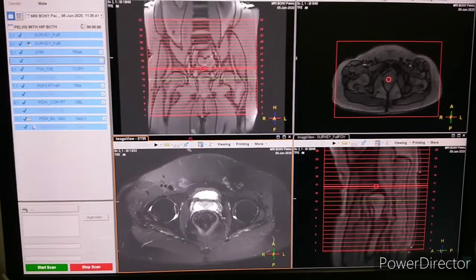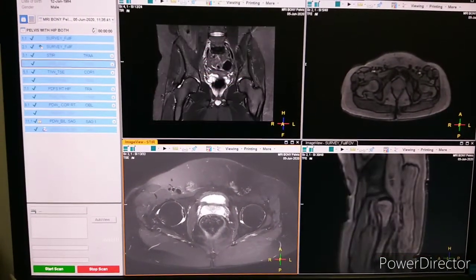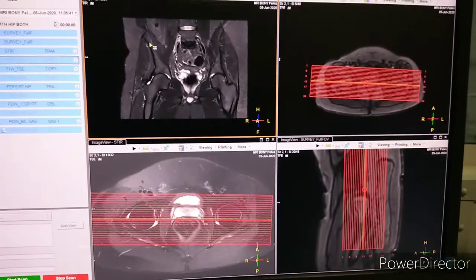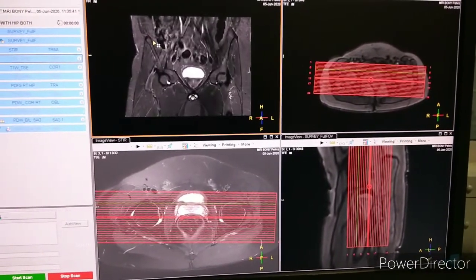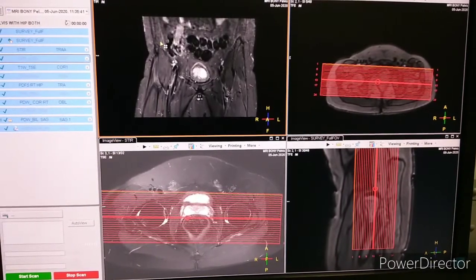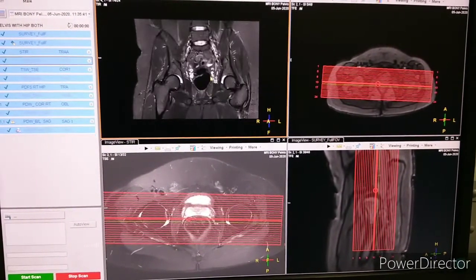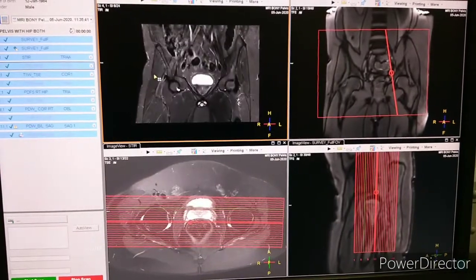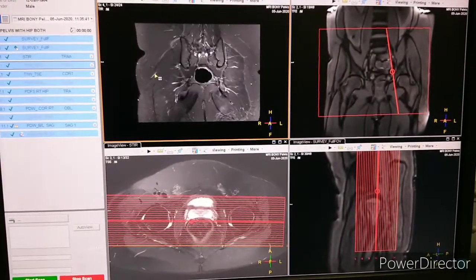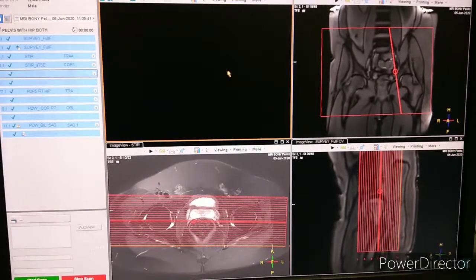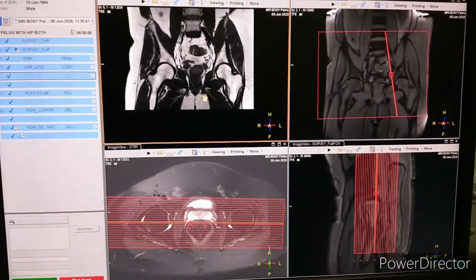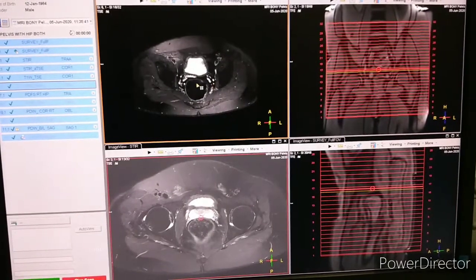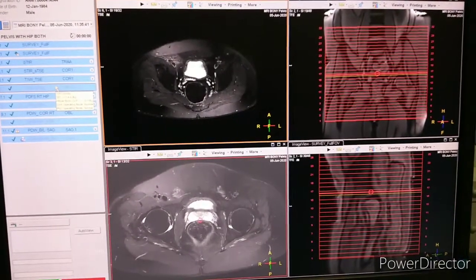Next sequence is STIR coronal. Here is the planning of STIR coronal. The planning of T1-weighted coronal is the same as STIR coronal. After STIR coronal, the planning of T2FS axial is again the same as STIR axial.